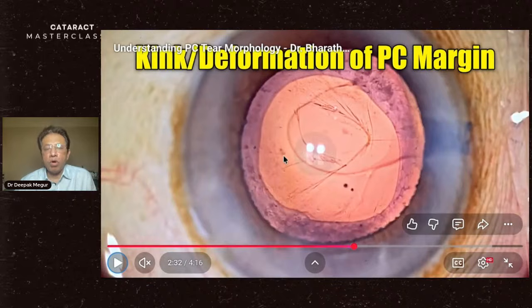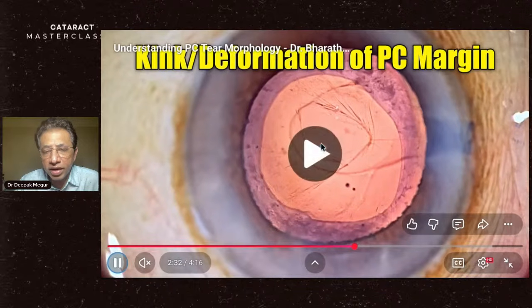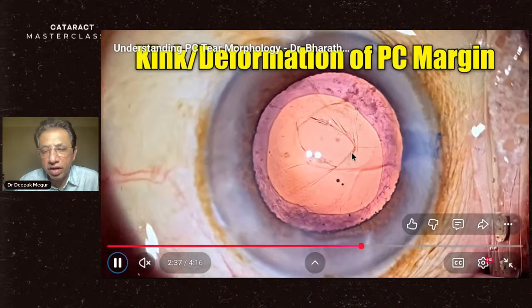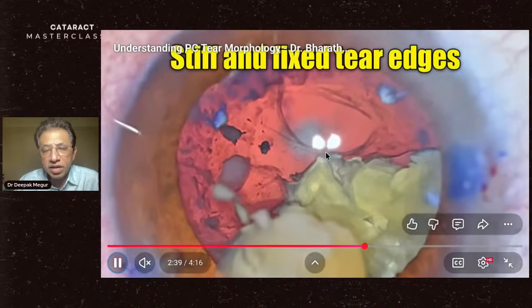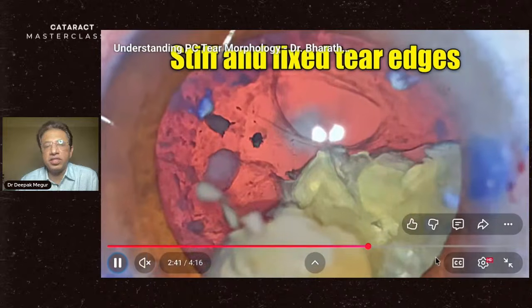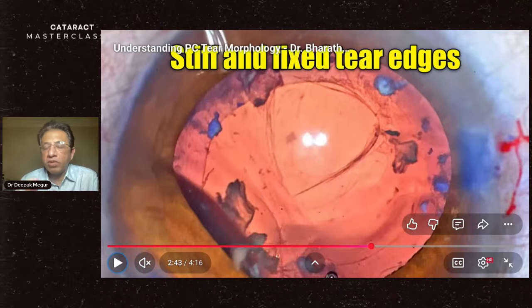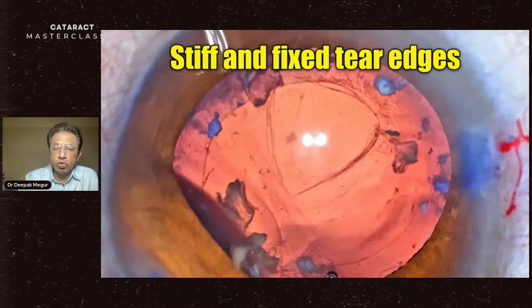Most importantly, there is a deformation of the posterior capsular tear. Can you look at it? There is a kink here. Whenever the margin is distorted, it is because the vitreous fibril is running across and dragging that margin. These edges will not be fluttering because the heavy vitreous is coating them, and that's why you won't have free fluttering of the edges.